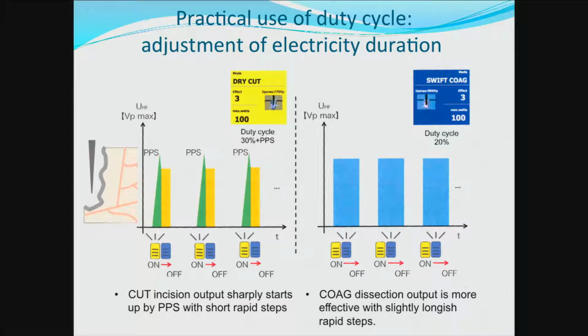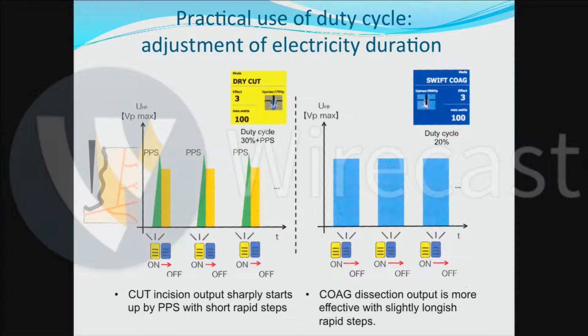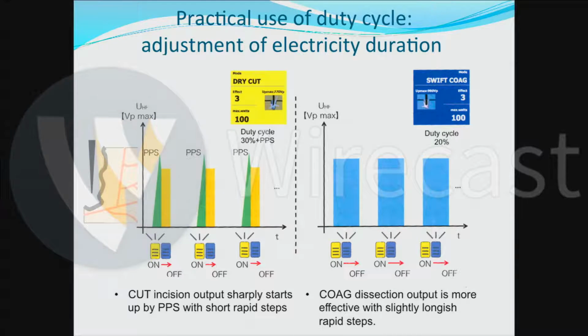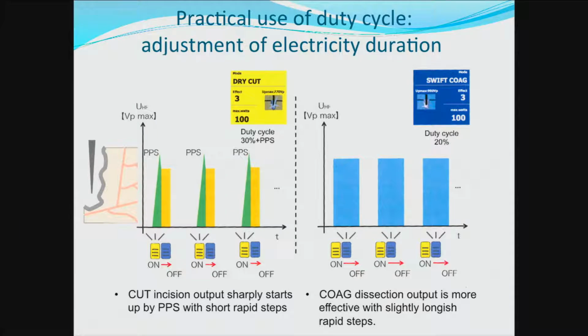The momentary release of electric conduction produces a shrinkage of tissue and a gap. The resistance of tissue rapidly rises, and the electric discharge, sparkle, and arc become instantly possible. The incision of Bio power peak system produces the maximum power under the load limitation cancellation within 300 watts. However, the power peak system does not work in coagulation. Therefore, the time lag between the start of electric conduction and the gap in coagulation is larger than that in incision.